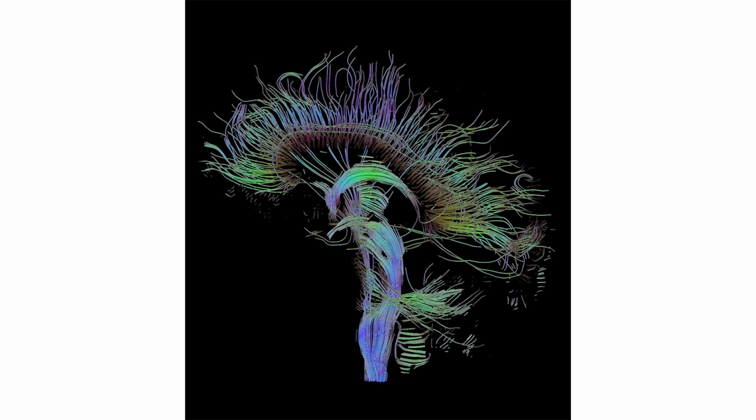Free diffusion occurs equally in all directions. This is termed isotropic diffusion. If the water diffuses in a medium with barriers, the diffusion will be uneven, which is termed anisotropic diffusion. In such a case, the relative mobility of the molecules from the origin has a shape different from a sphere. This shape is often modeled as an ellipsoid, and the technique is then called diffusion tensor imaging.